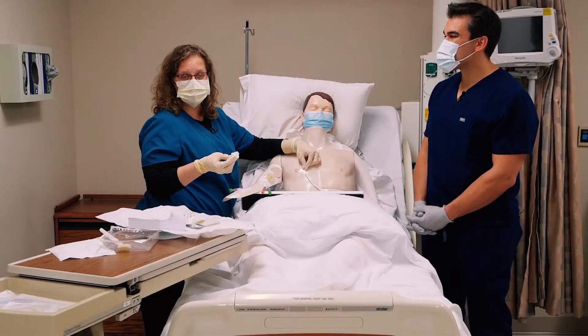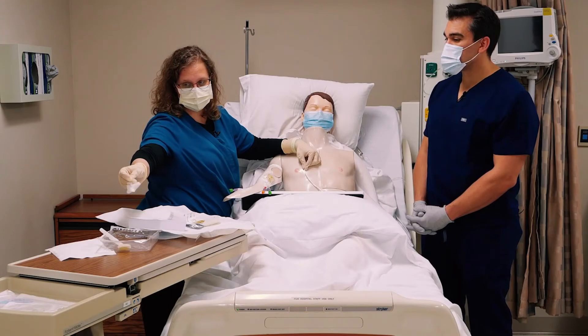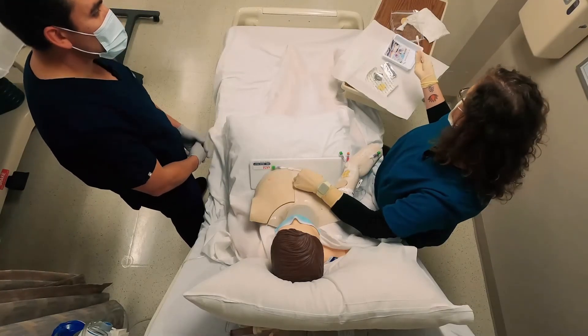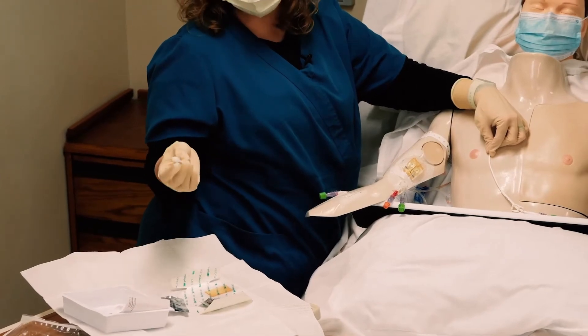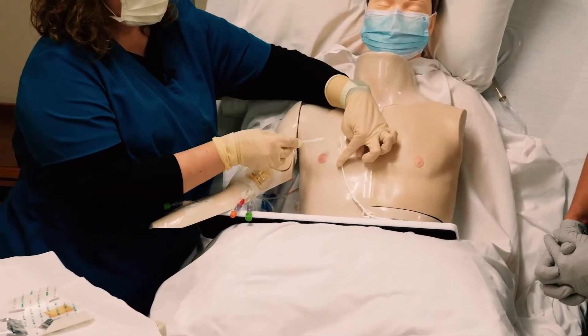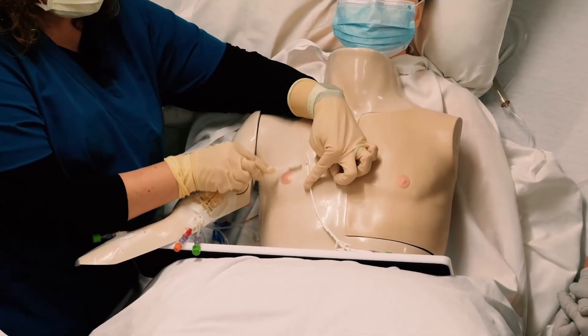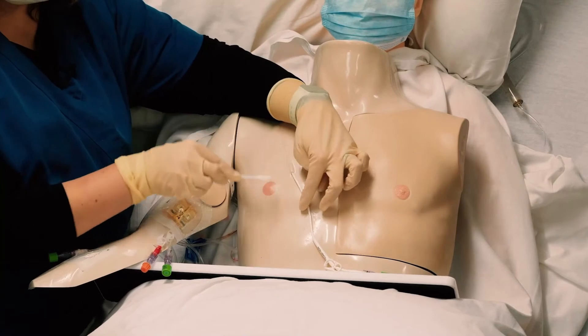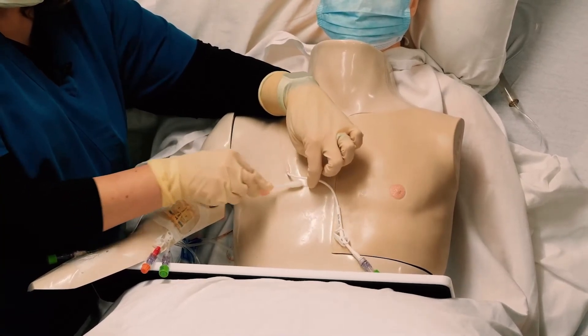For a regular patient, you're probably going to let it air dry — don't fan it, obviously don't blow on it. This is the skin protectant swab, and I don't want this on the actual entry site for the catheter. I want it on the outside edges so that the dressing adheres well.